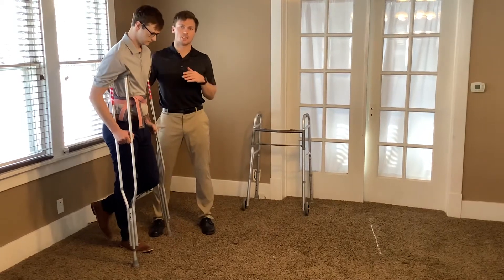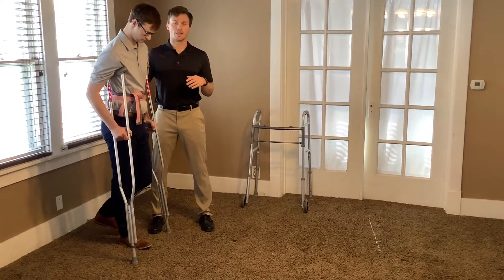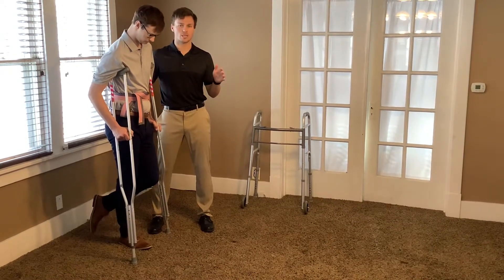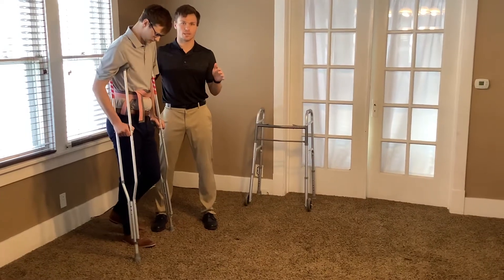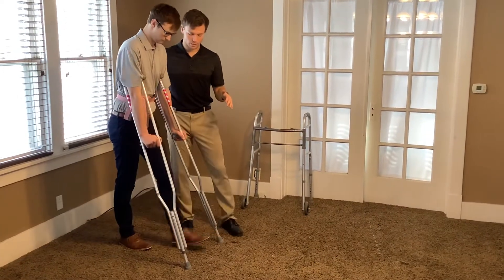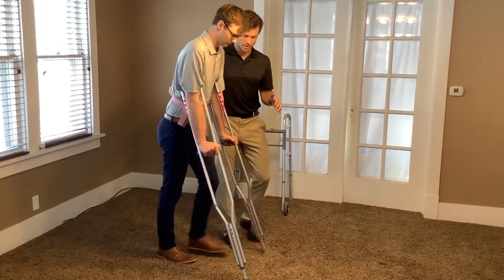A three-point gait pattern is used when the patient is non-weight-bearing only. We are going to move the crutches first, then cue him to move the affected limb — but that's non-weight-bearing, so there's no contact with the ground. Then I'll instruct him to move the unaffected limb, which is where all the weight will be going through. So the sequence is: crutches, affected (non-weight-bearing), then unaffected to bring himself forward.